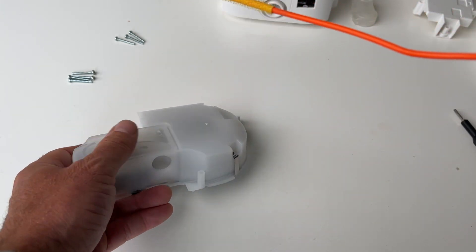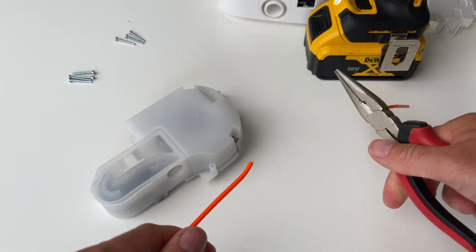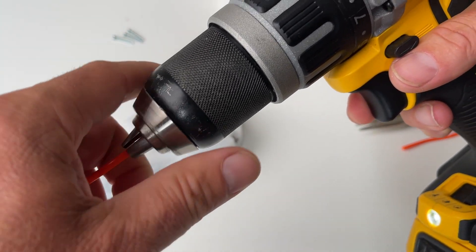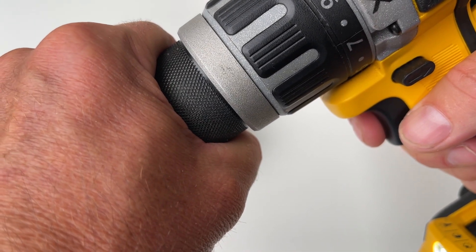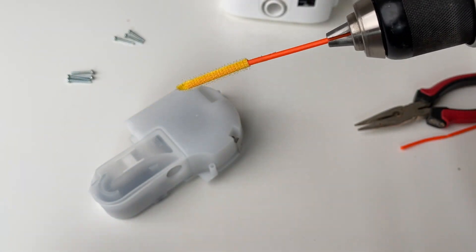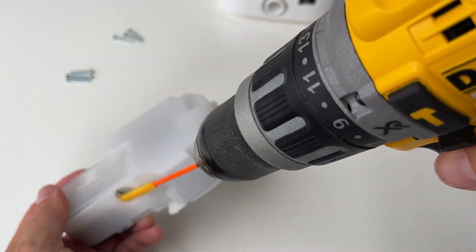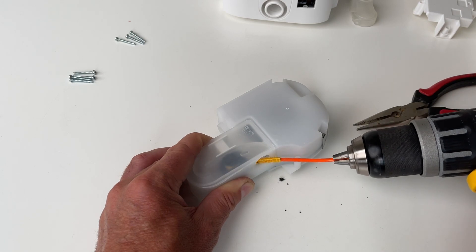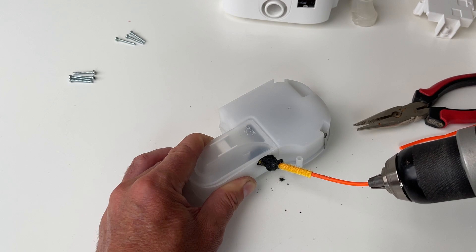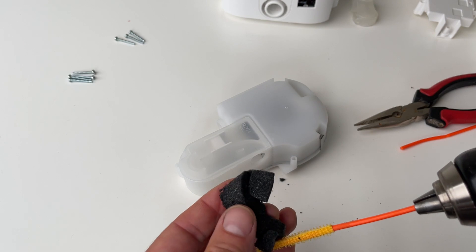I might even just make it a little bit smaller. All right, I hope I haven't strewed this. You just sort of put it in — there we go, there it is. That, my friends, is the foam.